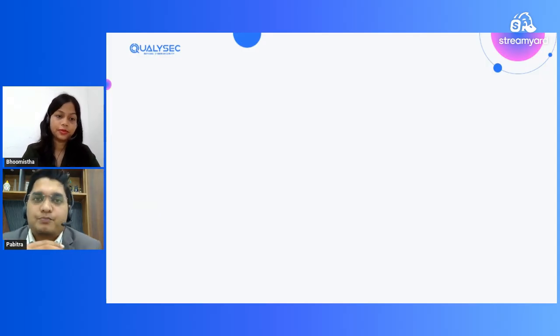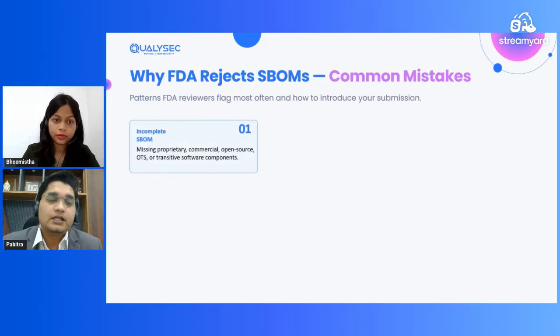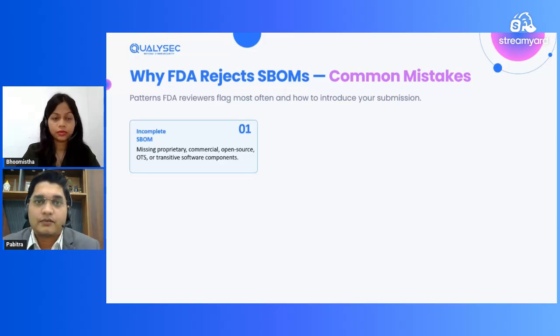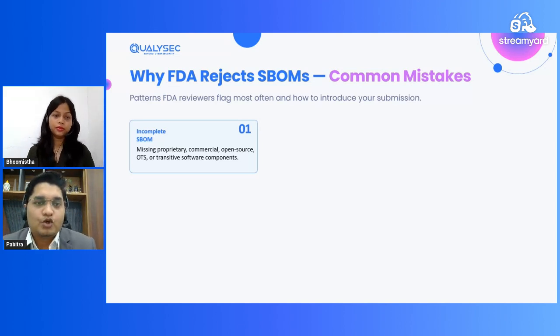let's discuss what the common mistakes are that compliance officers usually make so that they receive FDA rejection. Starting with the most common and very important one: incomplete SBOM. See, SBOM is not 6-7 pages of Excel. It is a whole different thing you have to prepare. People usually just list a few items, a few open source items, a few internal tools, and provide it as SBOM evidence. That is not SBOM. It's completely going to trigger the RTA.